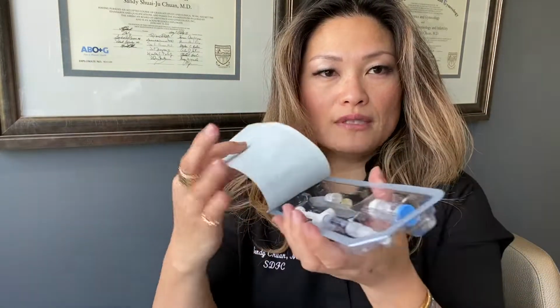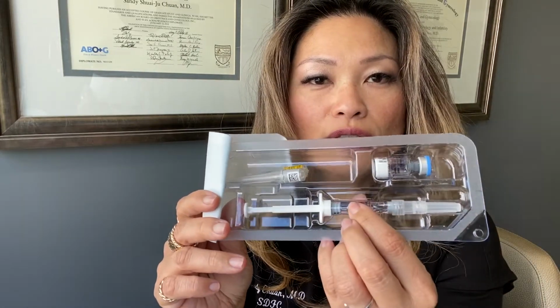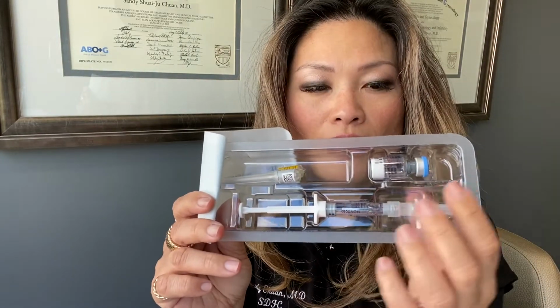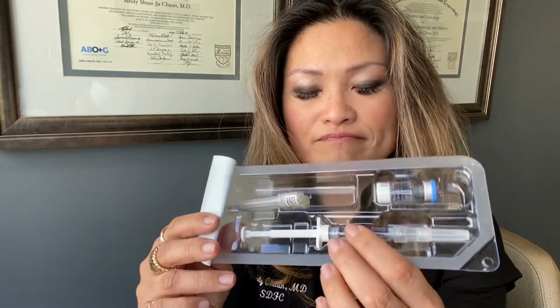So when you open up the Cetrotide, again, this is a demo pack, so it's already open, but you want to open it. It'll come in this package that looks like this, okay? And within it, when you open it, and this should be sealed, what you're gonna see is a pre-filled syringe with fluid already in it. You're gonna see another bottle of powder with a blue top on it, just like with other medications. Usually it's powder form to mix with fluid.